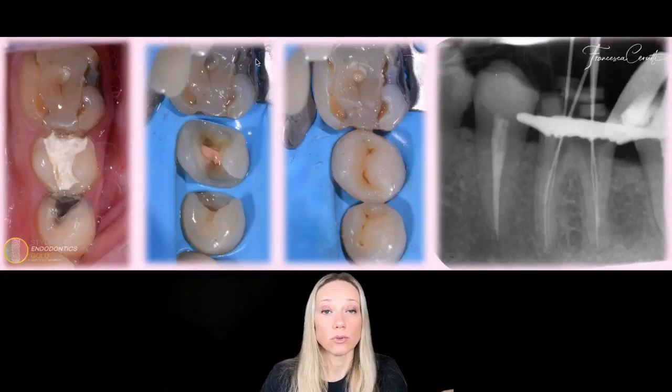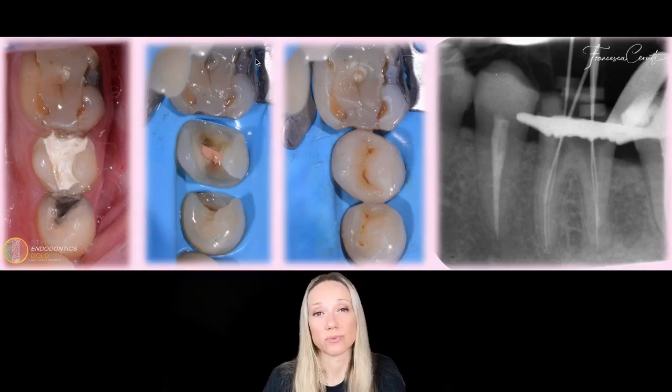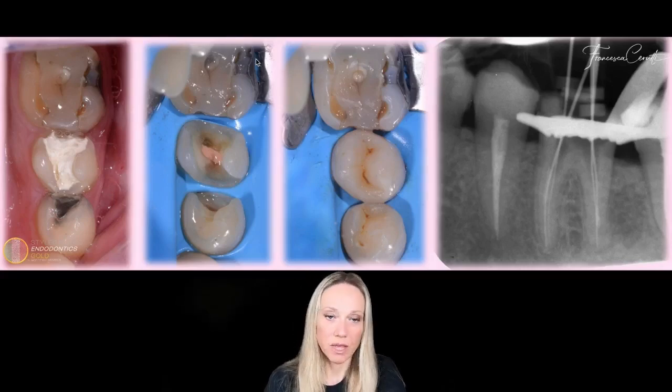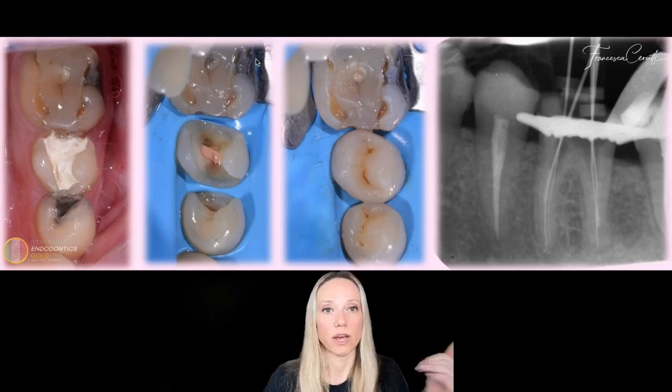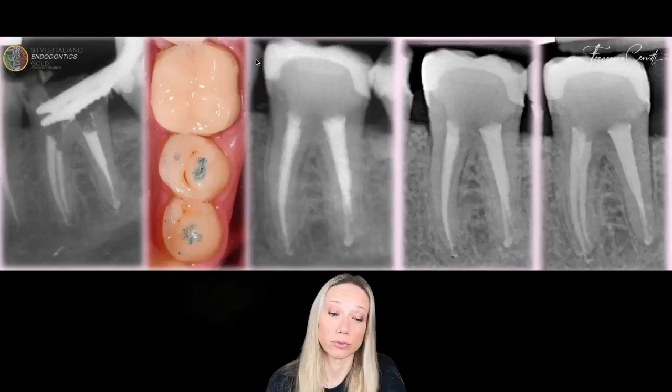I do as much as I can because it's more ergonomic for me, it's more ergonomic for the patient, and we have seen that the success rate of 1, 2, 3, 4, 5, 6 visits doesn't really change significantly. And so the more I can do in a single visit, the better in my practice. And so what do I do? I isolate, I do the direct restoration of the first lower premolar because it's decayed, I do the post-endo restoration of the second premolar, and I do the retreatment of the first molar because even in this case the existing therapy was not okay, and so I had to retreat.